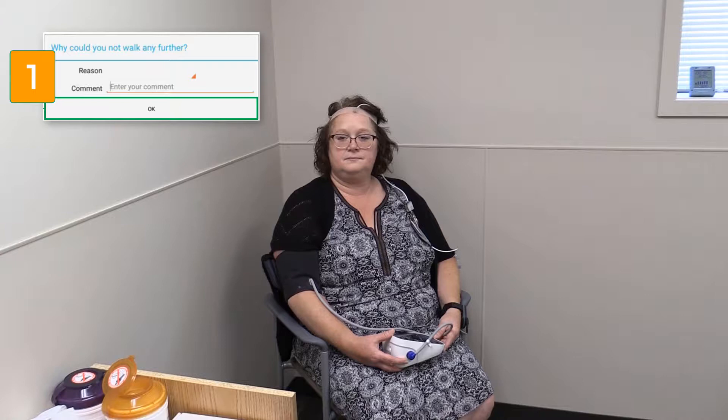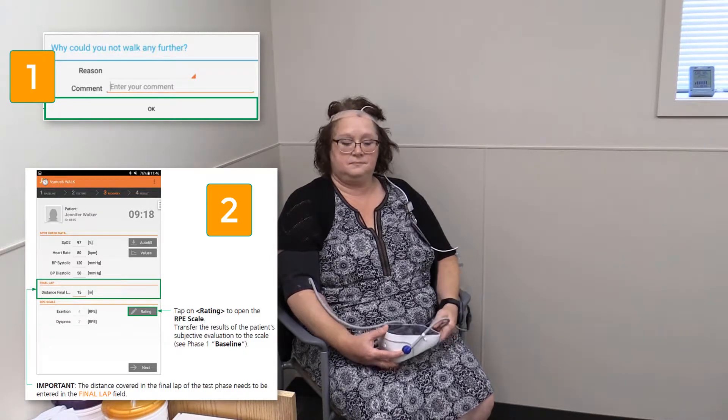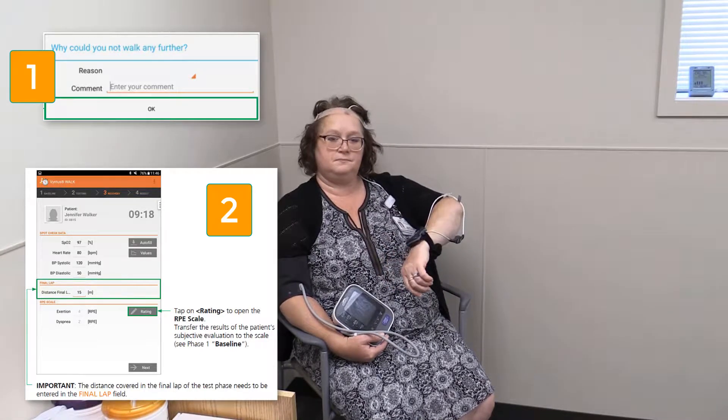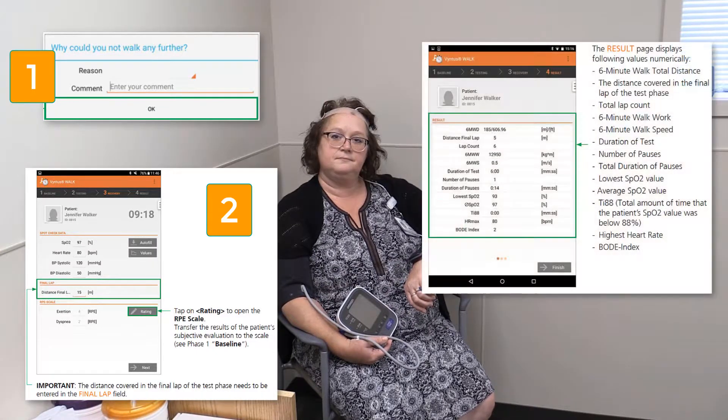Once we get our patient sitting, the 10-minute countdown timer will start for the rest period. During this time, we'll ask the patient to rate their peak dyspnea and exertion and enter these into the tablet by tapping the rating box. We will measure any partial lap distance walked following completion of the lap first, and enter this into the tablet as distance final. We'll also have the patient return to their seated resting position. At the end of the 10-minute rest period, we'll take another final blood pressure and enter the systolic and diastolic fields into the tablet. We will tap the autofill button to update the SPO2 and heart rate data.